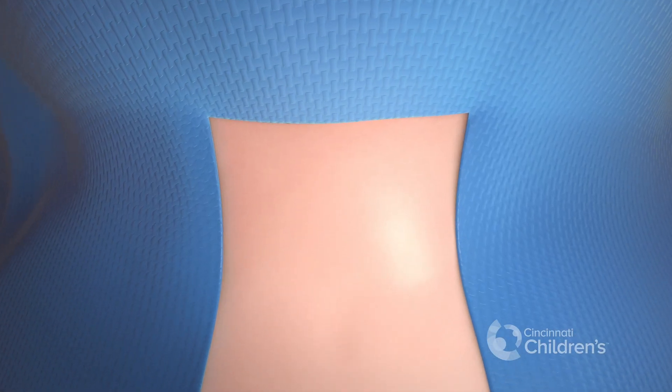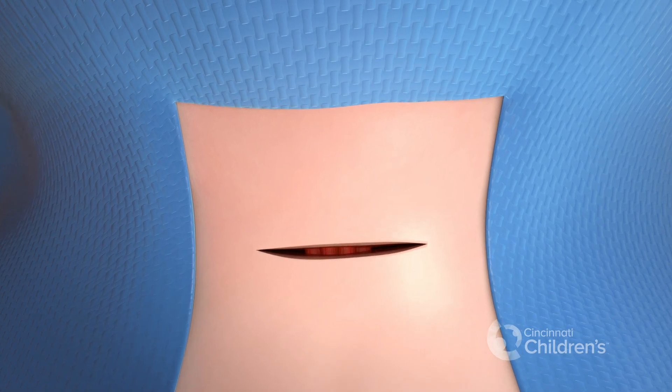Open repair is frequently used for severe clefts. A horizontal incision is made in the skin.